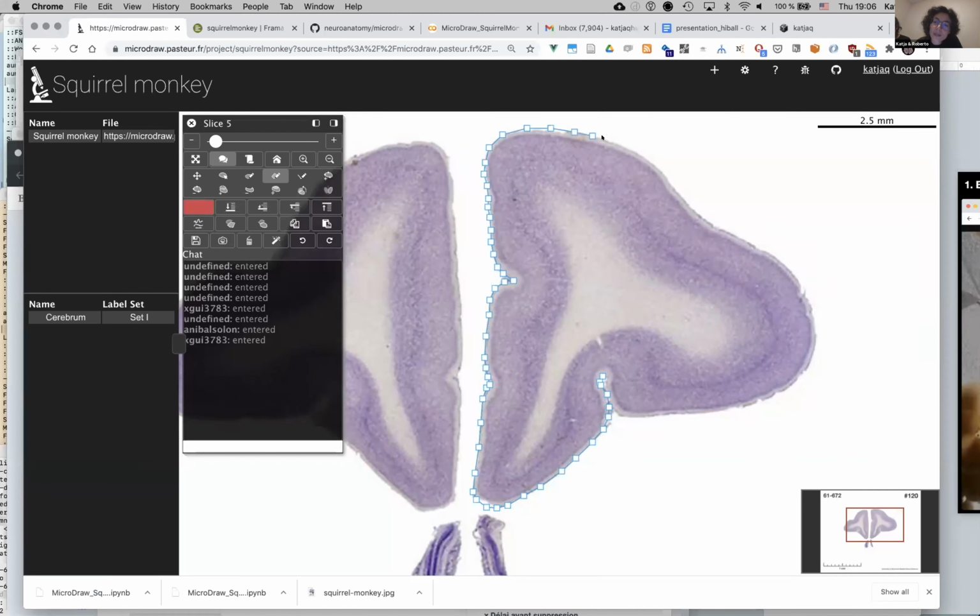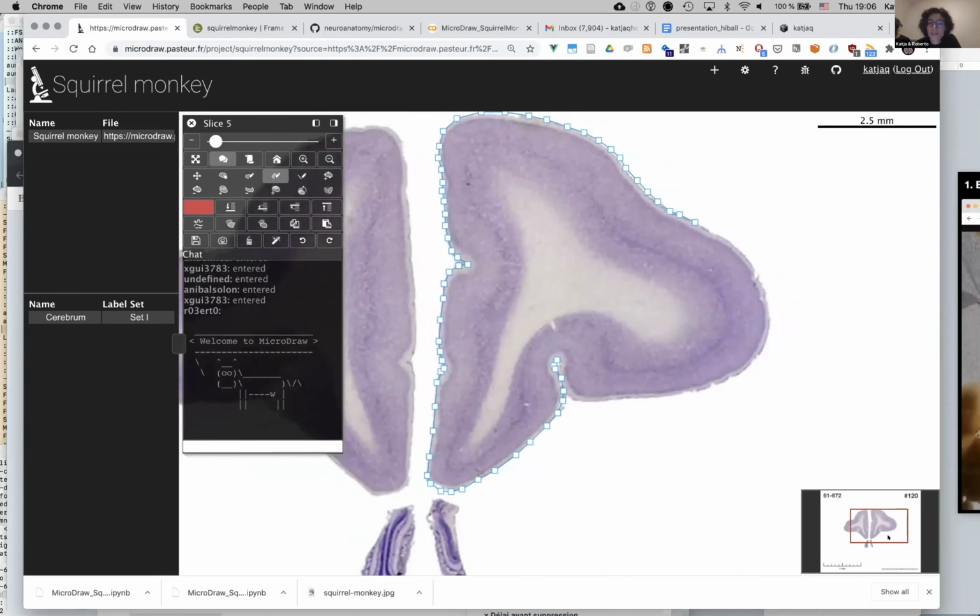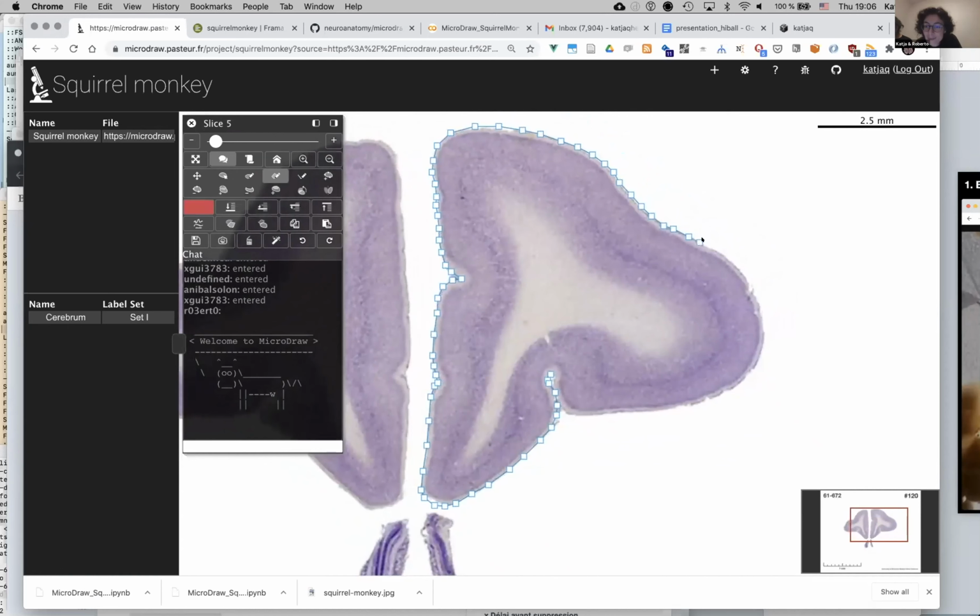And when you have these super high resolution images, as you've seen in the video that I was showing from Microdraw, you can zoom in to a much larger level, and then you have the navigator. So if you're too zoomed in to see everything at once, you can still use Microdraw and just navigate along the different pieces that you see on your screen.